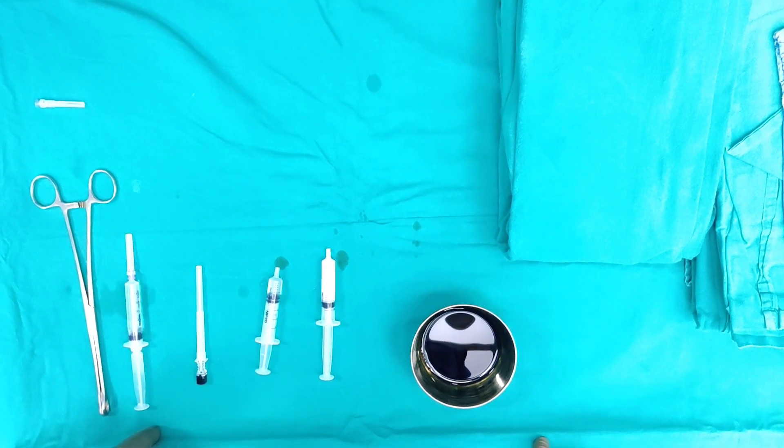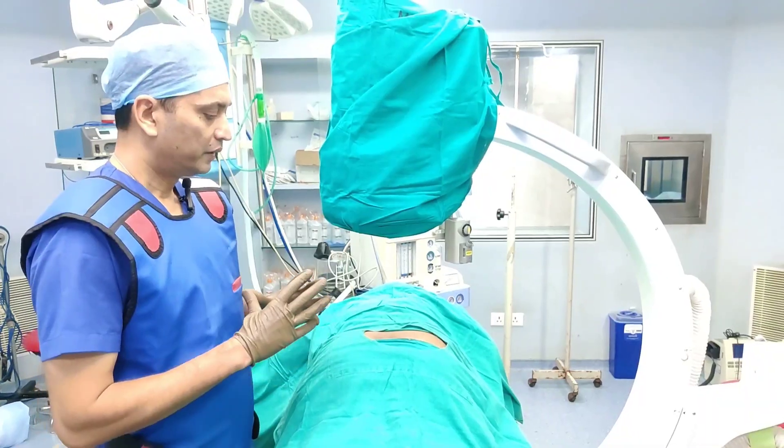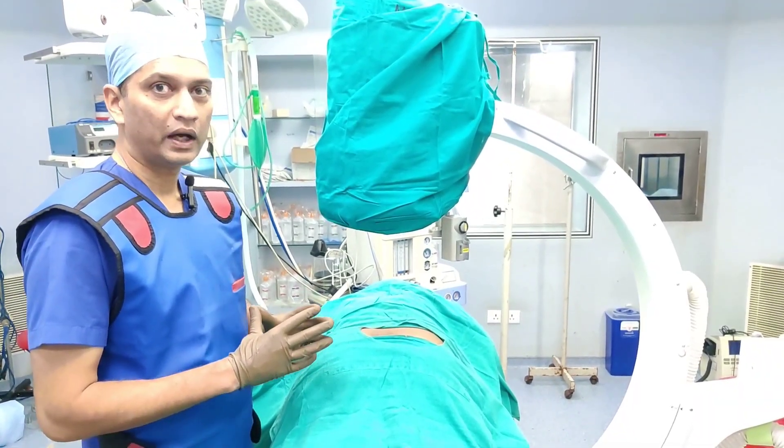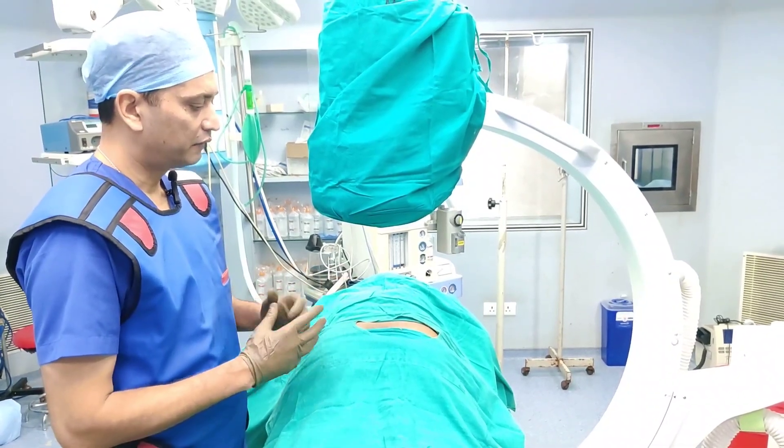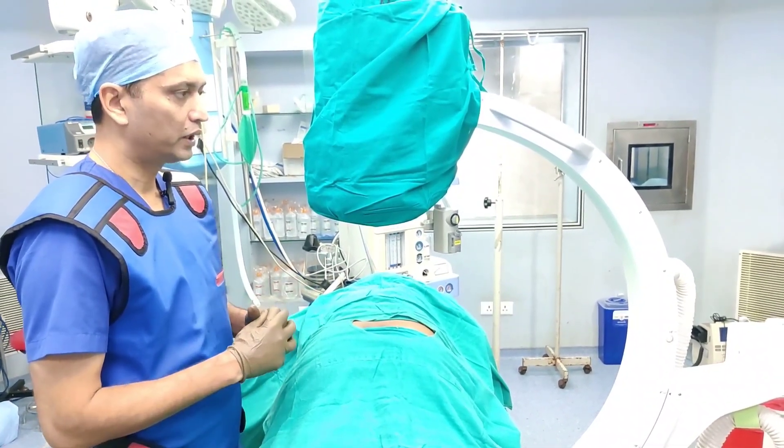The next step is to show you the radiology of the sacroiliac joint — what to localize and where to put the injection. When doing this injection you need to look at two views. The first is with your C-arm in neutral position; I'll take a shot and show you how it looks.